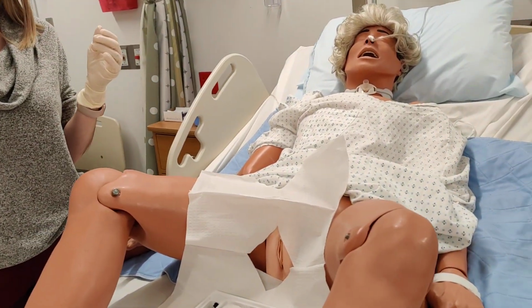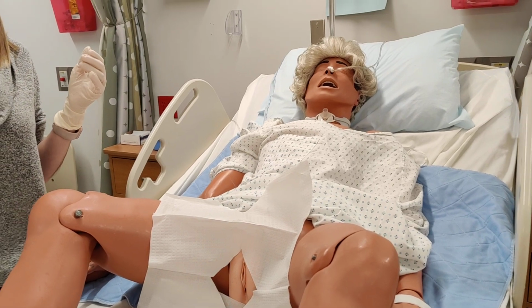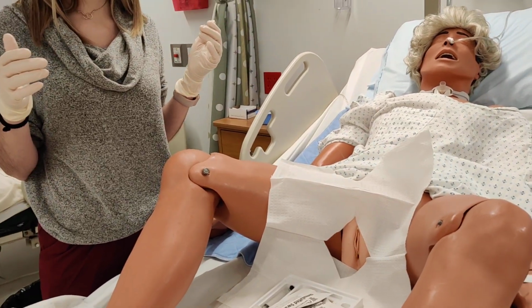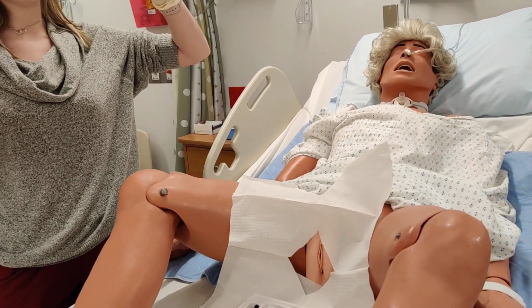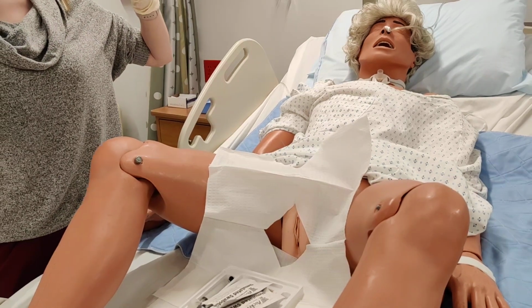With a female patient, the catheter is not being inserted quite as far. A male has a much longer urethra. All right, so at this point, she has her catheter lubricated. Now she's going to designate her left hand, and that's her non-dominant hand, as her dirty hand, and she's going to spread the labia.